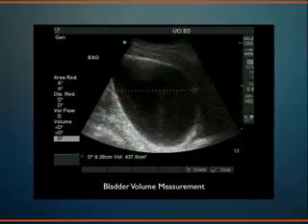So on transabdominal bladder ultrasound, we can measure the dimensions of the prostate. So measuring the prostate and having that post-void residual is in many different locations, whether you're in the outpatient clinic, you're in the ER, you're in the ICU, those are all good information to have about your patient. Does that answer your question?